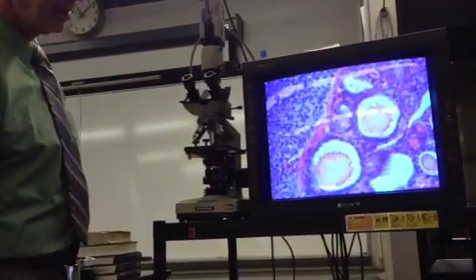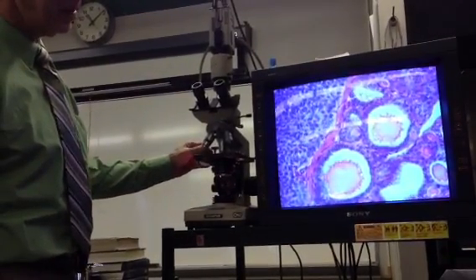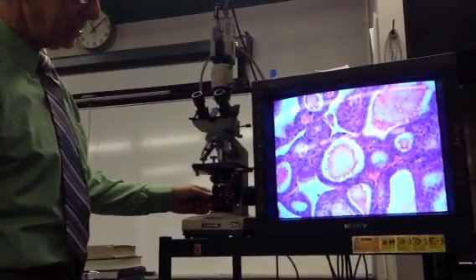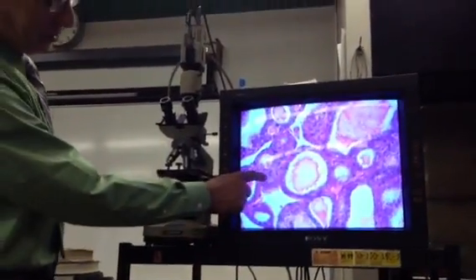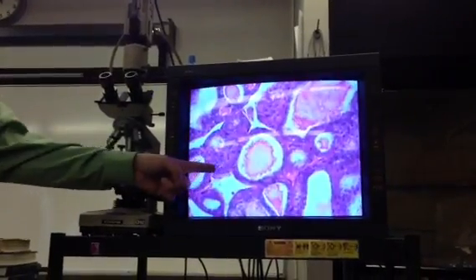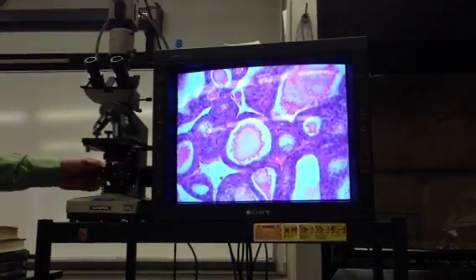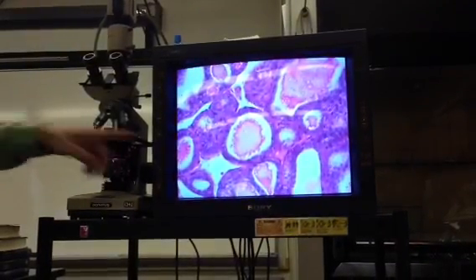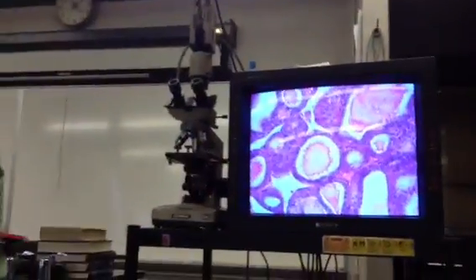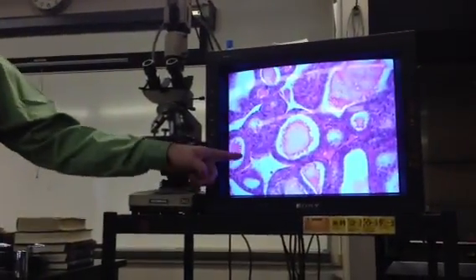So anyway, the only cell type here really is the... No, I forgot. Yes, that's true. There are also the C cells. Thanks for reminding me. I didn't see any jumping out at me. But here's one. If you see a very bright chromophobic cell that's clearly not in a follicle, that's a C cell that makes calcitonin. You see how that's sort of clear. It's obvious. It's a nucleus that appears backlit because the cytoplasm has nothing in it that stains, and it's clearly not associated with the follicle.